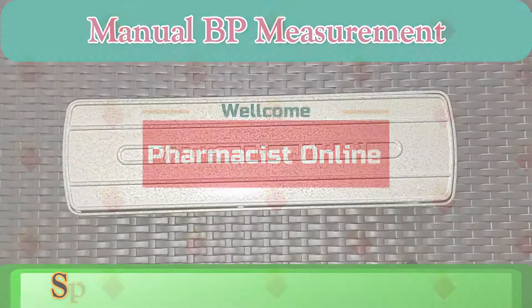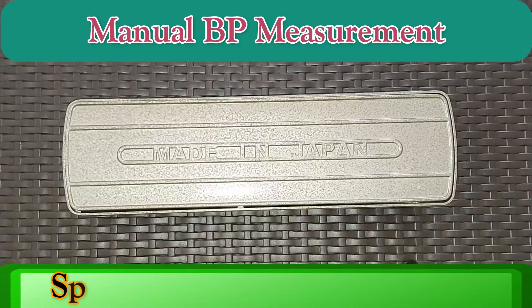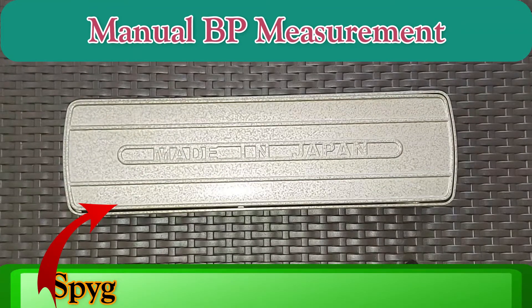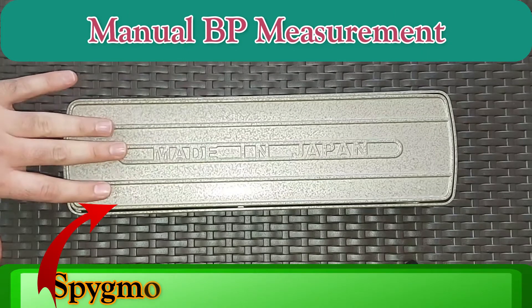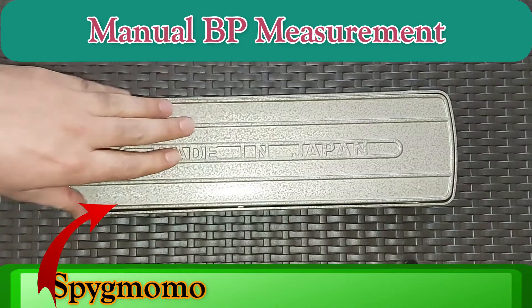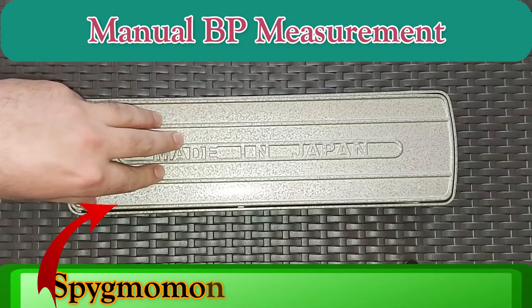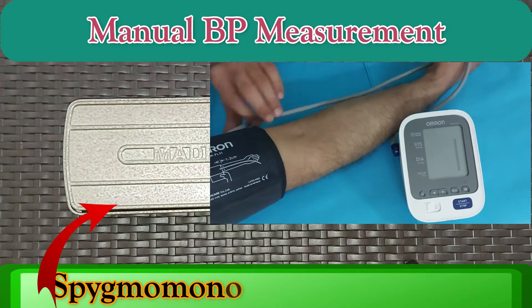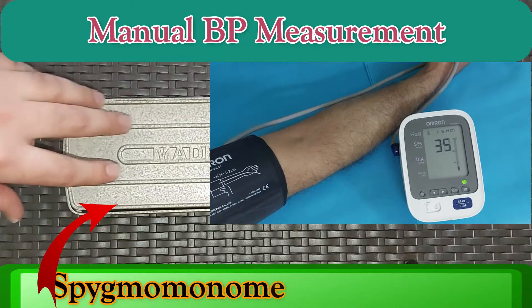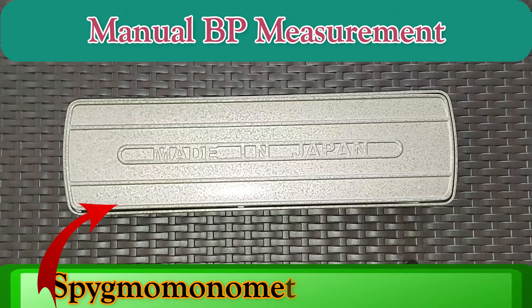Hello viewers, hope you are all doing well. First of all, I'm going to talk about this — you can see here in the video — this is something called a sphygmomanometer, or the BP apparatus. The difference between this apparatus and the other one used for BP measurement is that this is for manual blood pressure measurement, while the other is automatic — you just put on the BP cuff, push the button, and it works. Here, things are different, so I'm going to talk about how to use it. But before we go to the use, I will show you the parts of this sphygmomanometer.